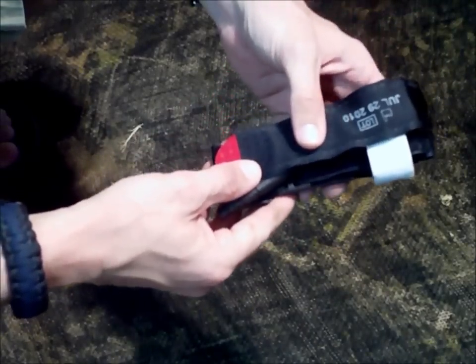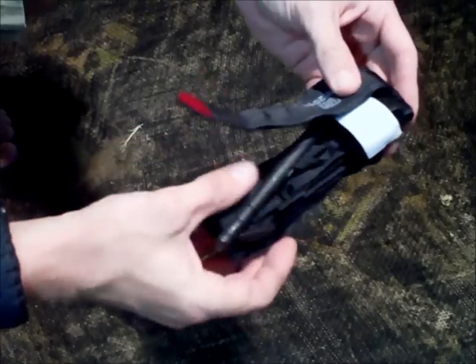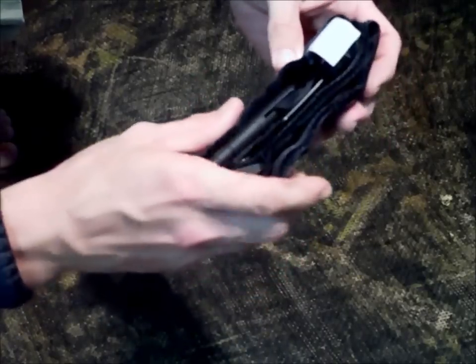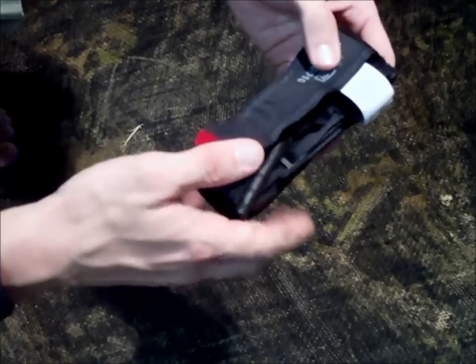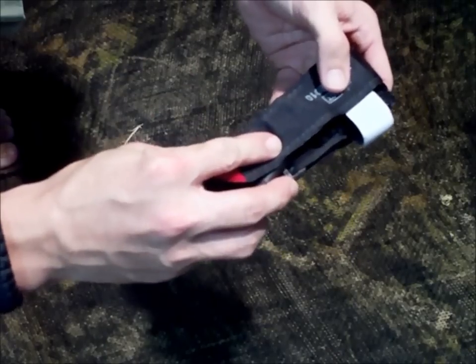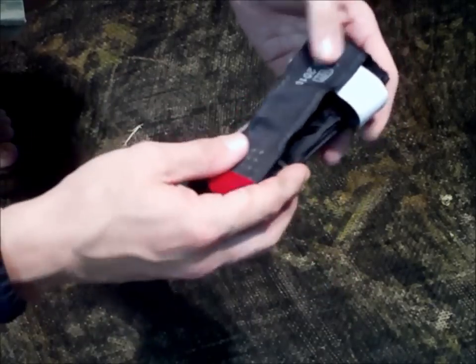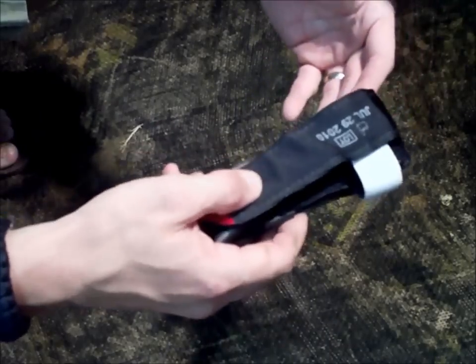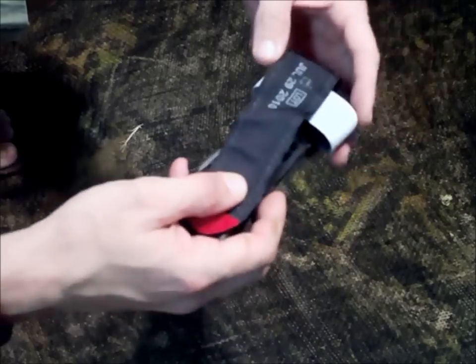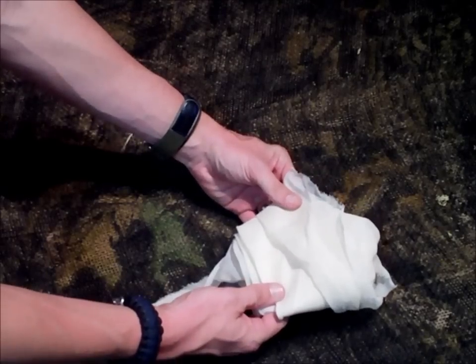This is an example of the CAT tourniquet — a commercial device that's relatively inexpensive. You can pick these up for about twenty dollars. I keep several in my pouches and bags. It works great for controlling life-threatening arterial bleeding. But in this video we're talking about what if we don't have one — what if we're just down to what we have in our bug out bag or everyday carry bag.